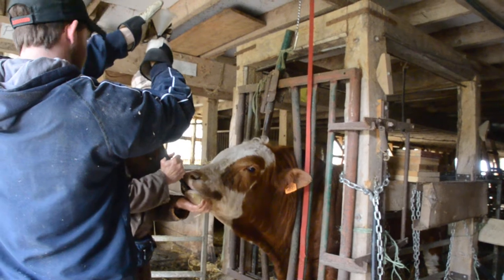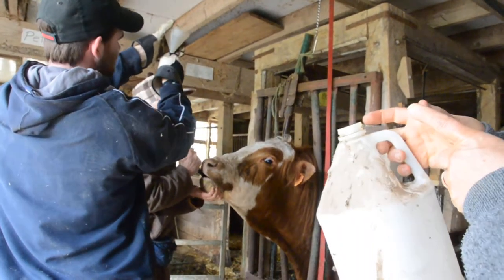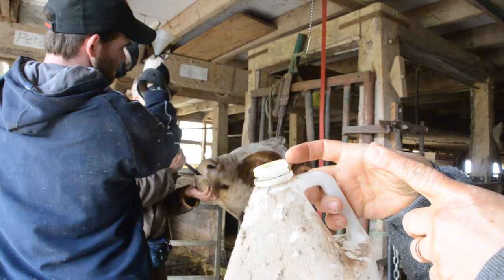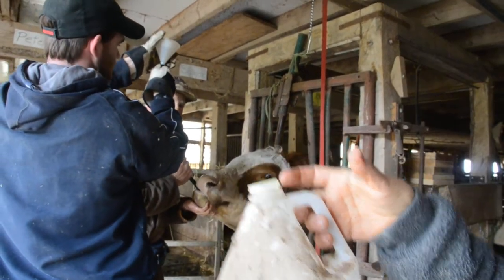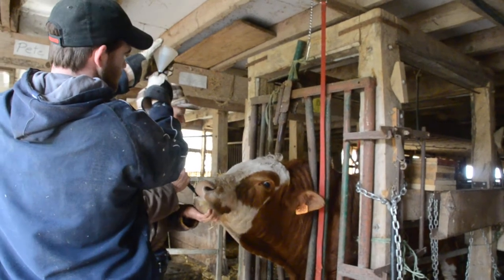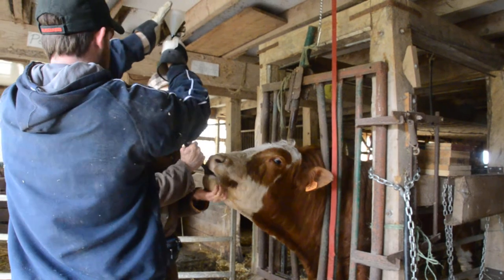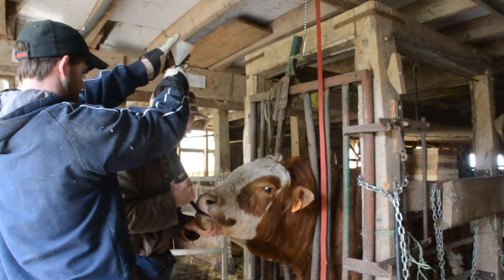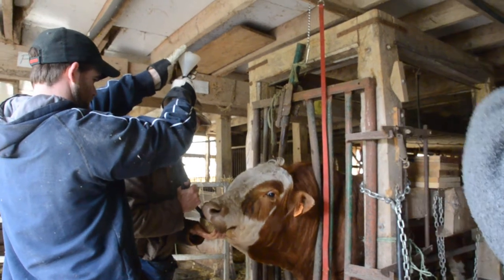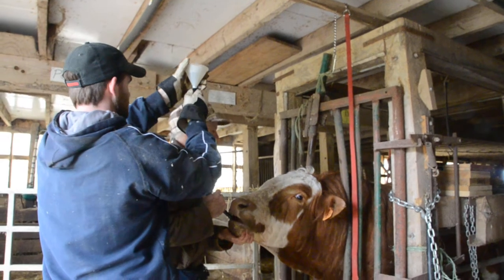The tricky thing when putting a stomach tube down is that the esophagus and the trachea join at the back of the throat, so you have to make sure you get it down the esophagus and not into the lungs. One of the tricks is to make sure the nose is below the eyes when you feed the tube in, so that it tends to go into the upper one, which is the esophagus, because the trachea is below.